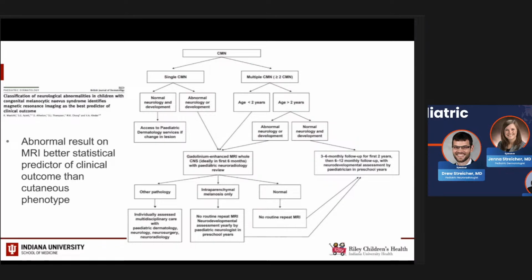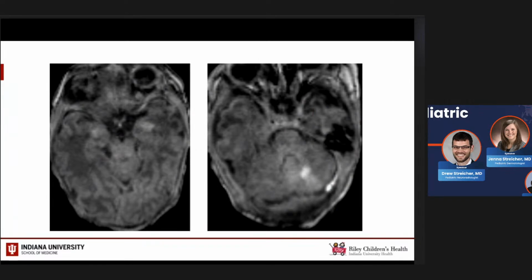Okay, all right, so let's jump into some imaging. I think that was a really helpful review of the importance of our imaging and how these patients are stratified in different risk categories. Abdul, are you available? Yes, I am. Okay, great. I'll have you take this case. I know it's a little fuzzy and blurry, but it's the reality of doing these feed and swaddle 2 to 3 month old babies. So we get used to reading it.